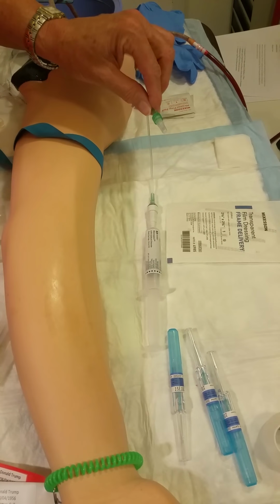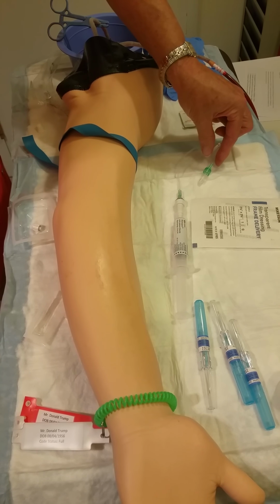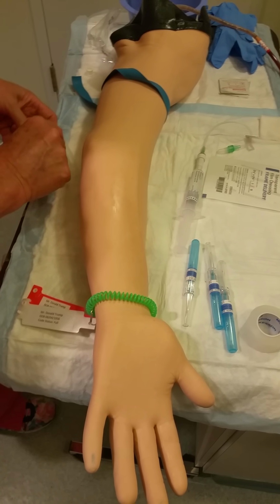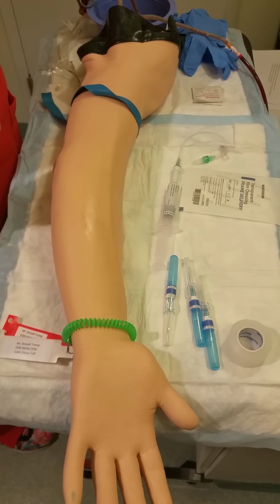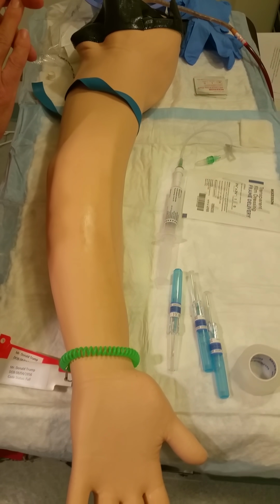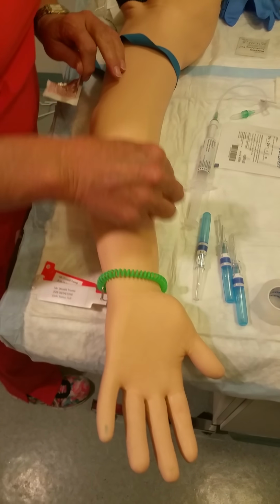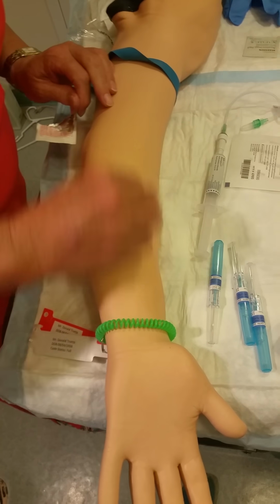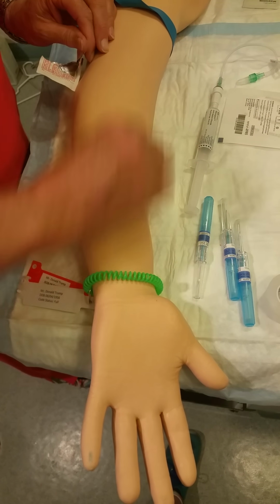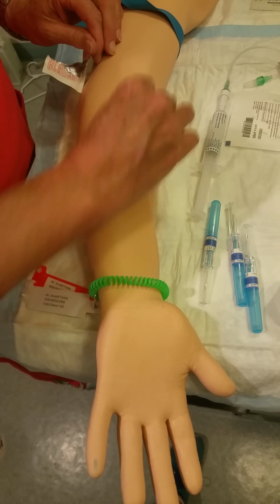I'm going to loosen that cap so I can easily remove it and attach it to the catheter hub. So, Mr. Trump, are you ready for me to stick you with the needle? I'm ready. All right. I will clean the skin, as I mentioned before, 15 to 30 seconds with a good brisk scrub on the chosen site, going back and forth to clean the skin.